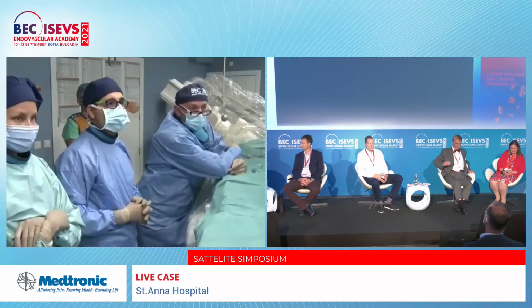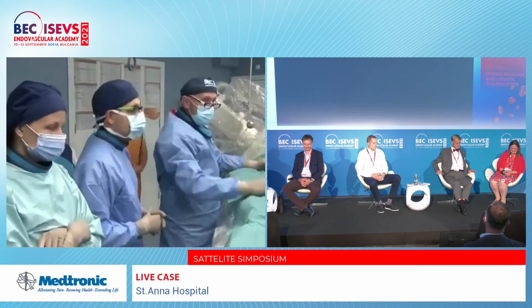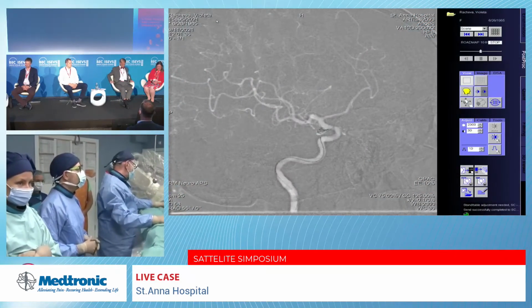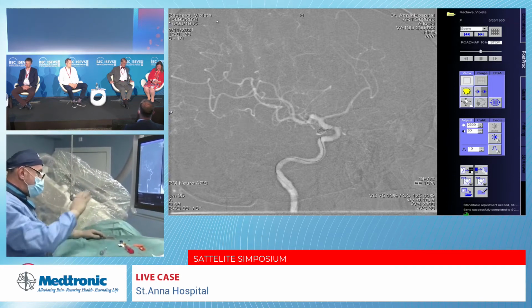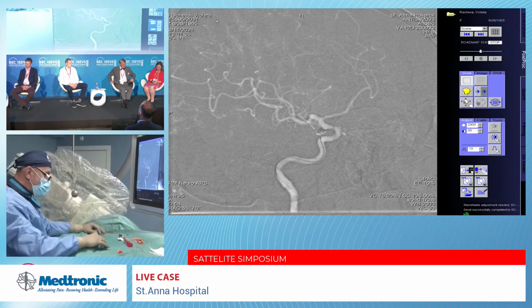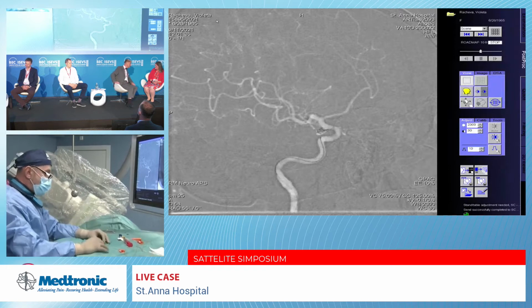Hello. Hello, Iris. Hello, we hear you. Now we can see you as well. Till now, we have a 6-French distal access approach with React 071 on the siphon on the right carotid artery, and after that we are with Phenom 27 in the middle cerebral artery.